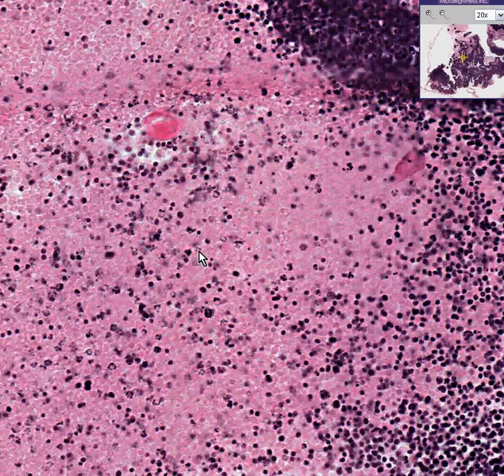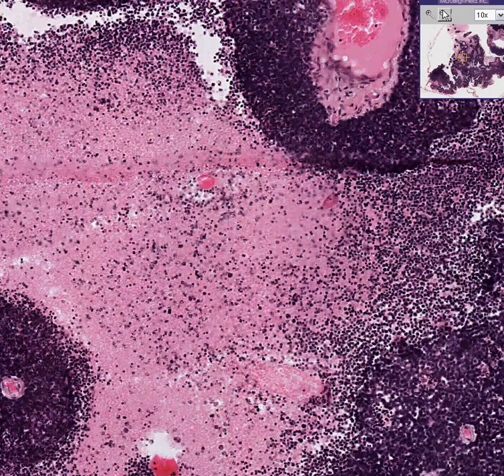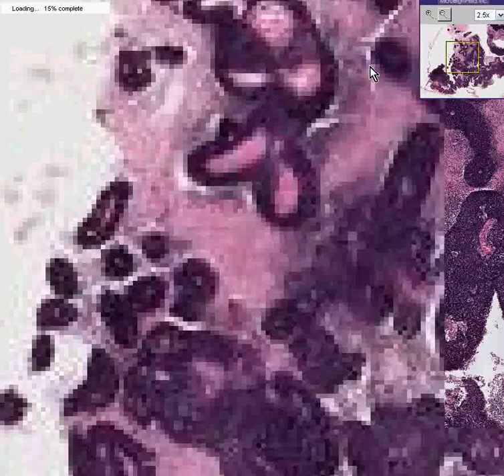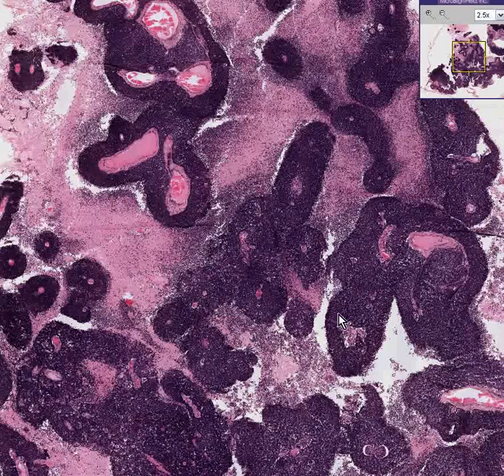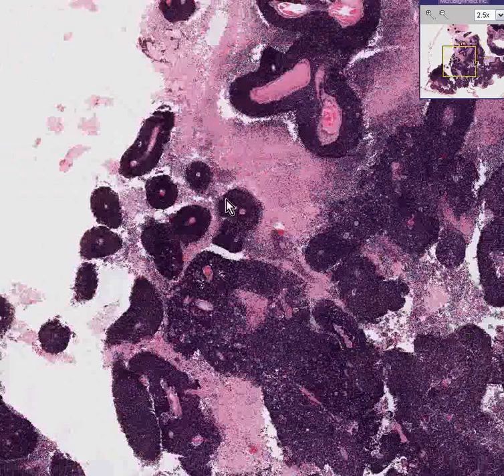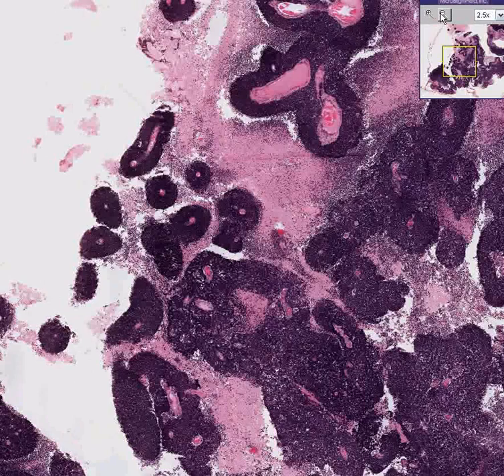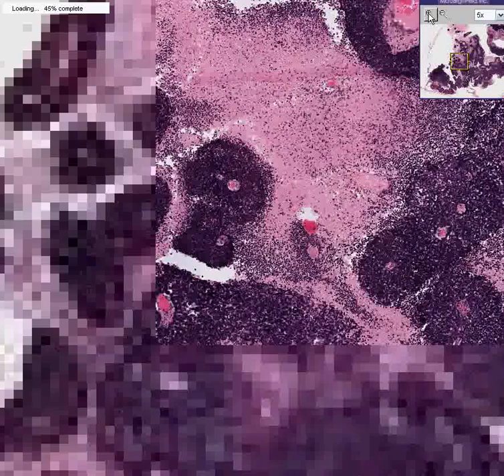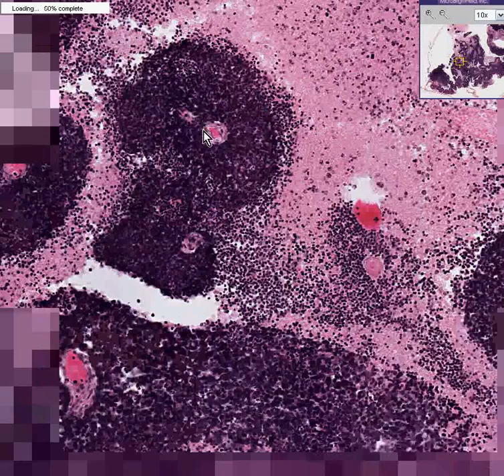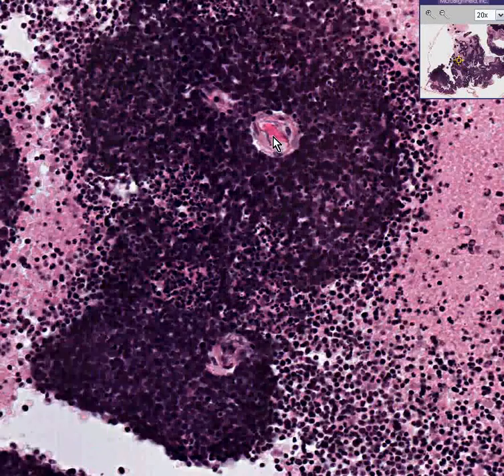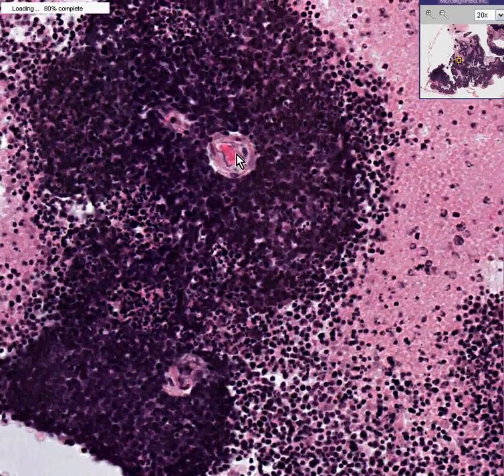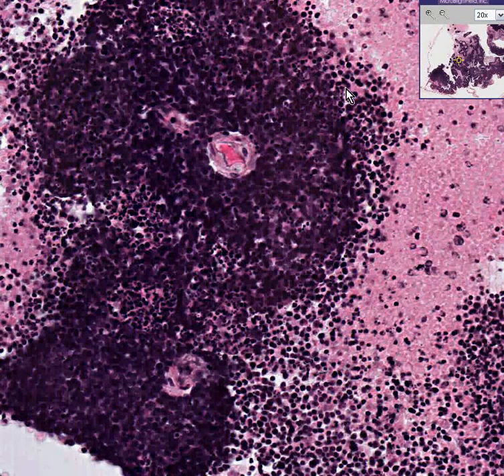Although you can see a lot of inflammatory cells. The other feature of this tumor is that most of the dark, more viable tumor cells all appear to be growing around blood vessels. This is a classical perivascular tumor cell pattern in which you see a central blood vessel, and then the tumor cells seem to grow around it. Because this tumor is growing so fast, when it finally outgrows its blood supply, it becomes necrotic.